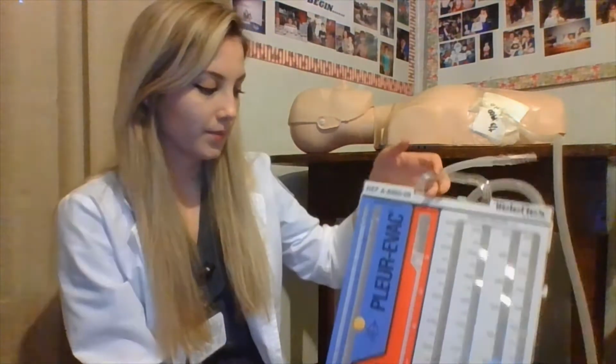You also want to monitor your drainage system. With this, you're going to look at your collection chamber, and you're going to look at the amount and the color that the patient is putting out, because it's likely that the physician will ask you for this. So check it quite regularly and keep track of what they're putting out and what it looks like.